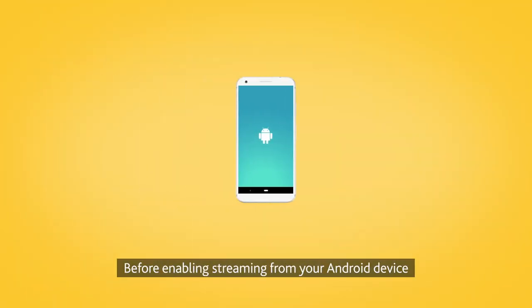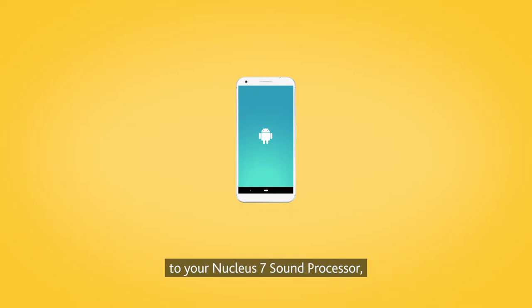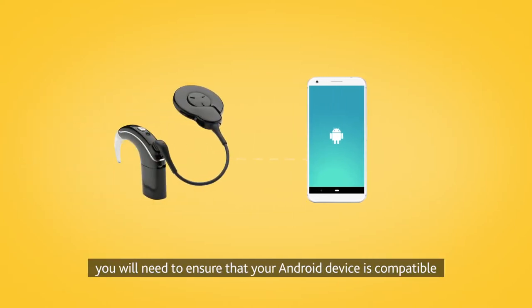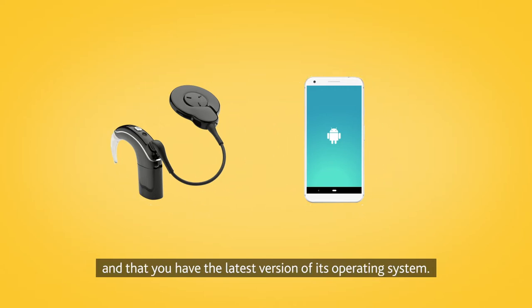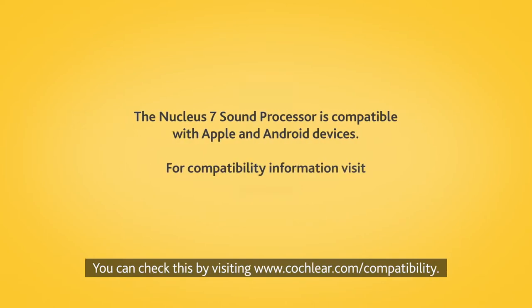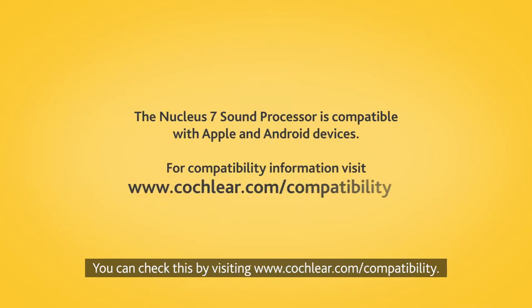Before enabling streaming from your Android device to your Nucleus 7 sound processor, you will need to ensure that your Android device is compatible and that you have the latest version of its operating system. You can check this by visiting www.cochlear.com/compatibility.